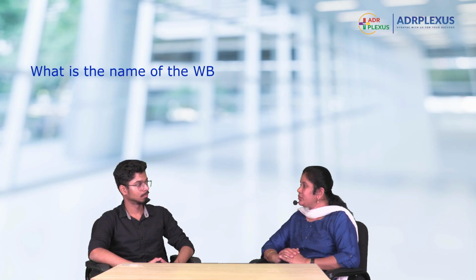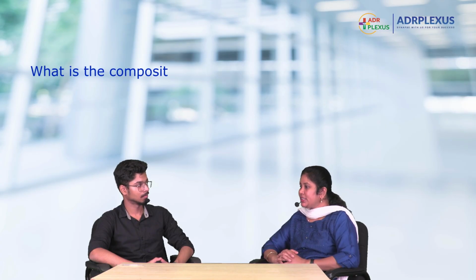Okay, Navin, we'll move on to WBC count, which is another major experiment. What is the name of the diluting fluid used here? Turk's fluid, ma'am. Turk's fluid. Good. You should not pronounce it as Turkey fluid, okay? Yes, ma'am, it is Turk's fluid. What is the composition of Turk's fluid?